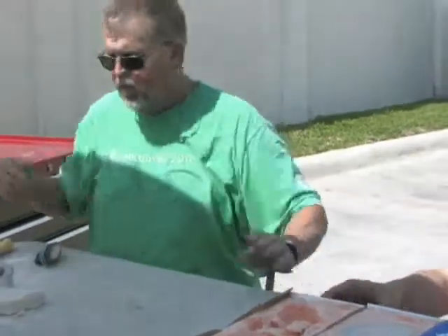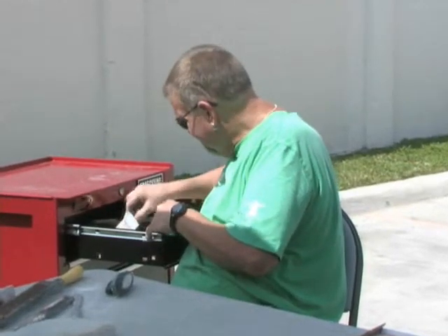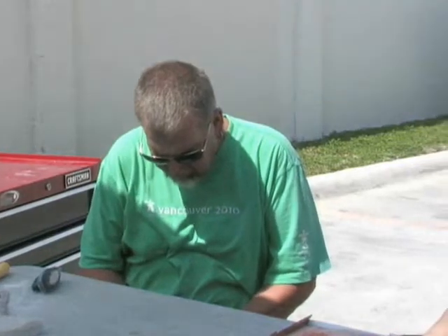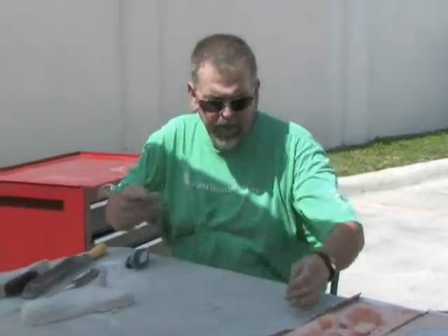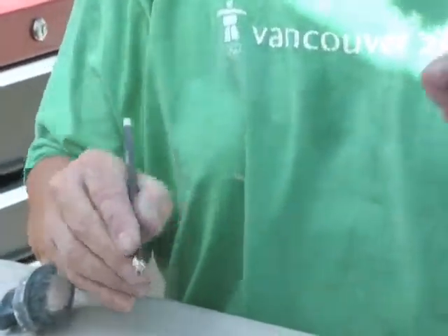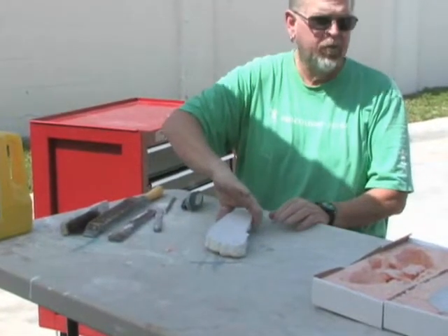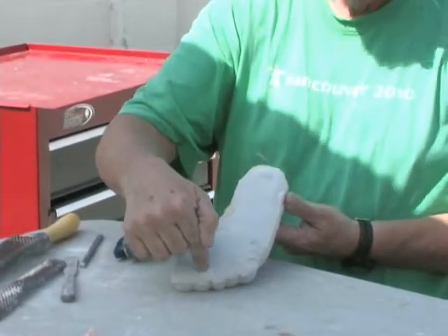We have a little pencil here — it's called an indelible pencil. What I'll do with this: if you recall, we wanted to talk about three points of contact. The easiest way for me to do this — I'll put a little scratching across the table and run this cast across, and if it was done correctly it should have three points of contact, and it does: one, two, three.